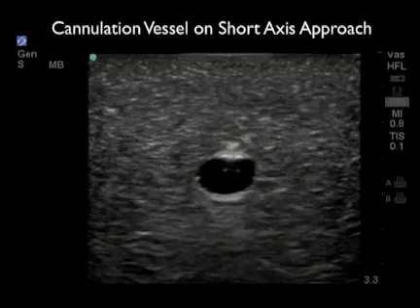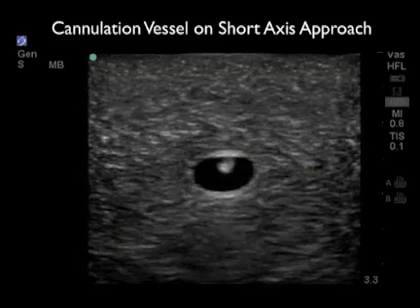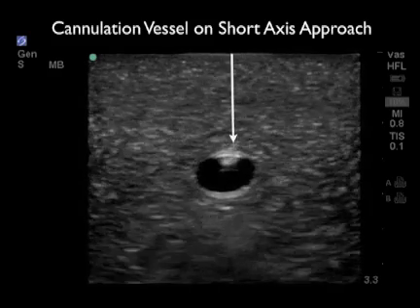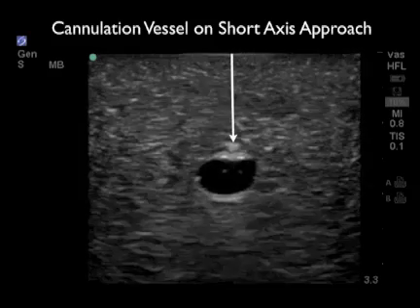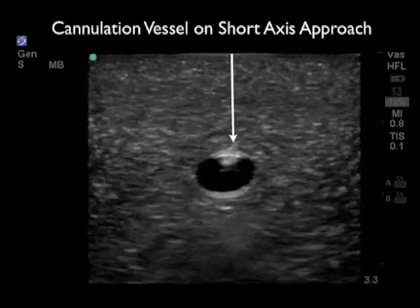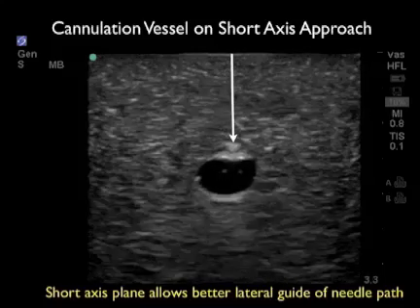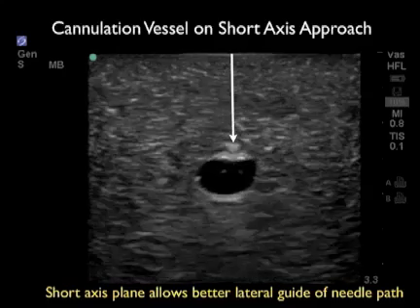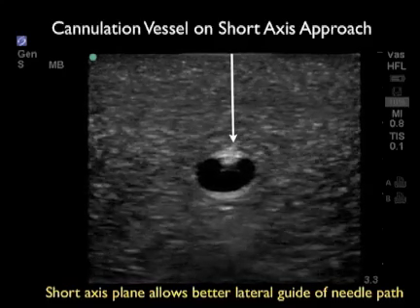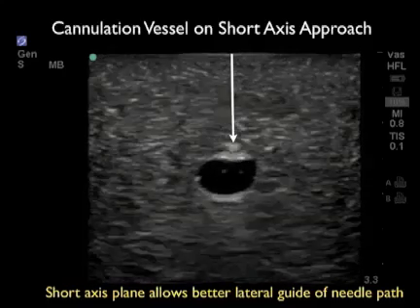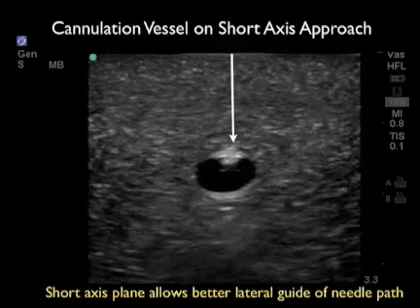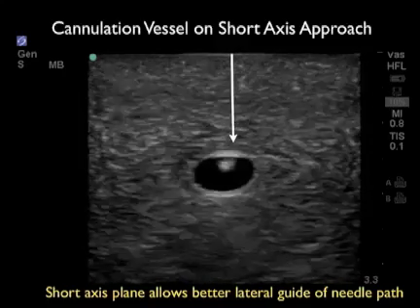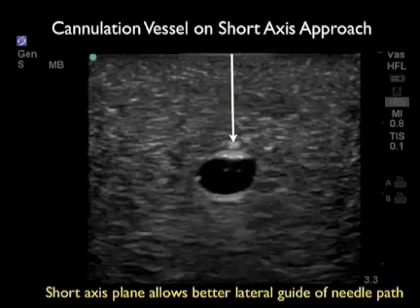In this video clip we'll watch cannulation of a vessel using the short axis approach on a phantom simulating the human body. With the probe in short axis orientation, the vessel appears as a circle end-on. We can see the echogenic tip of the needle coming down to the vessel, permeating the anterior wall, and then entering into the lumen. The short axis plane allows better lateral guidance of the needle path and is a good starting position for cannulation of the axillary vein.